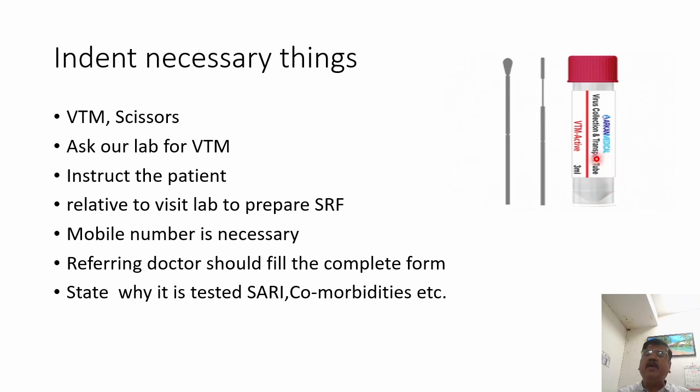You can see the photograph here: VTM is there, swabs are there. And sometimes if the swab cannot be broken, then scissors may be required because the length of the swab will be more. So we have to cut it so that it will fit in the VTM tube.